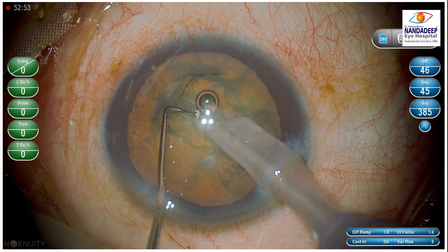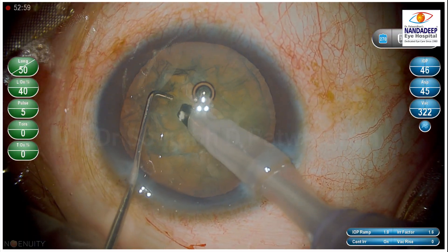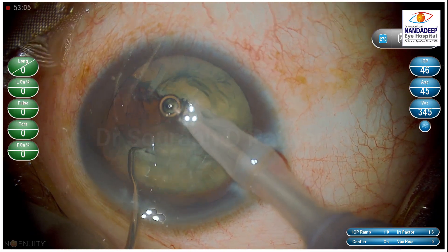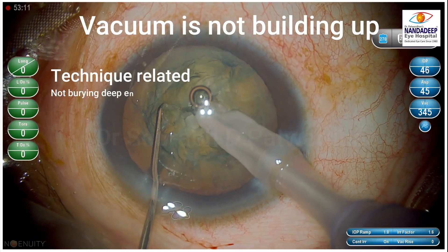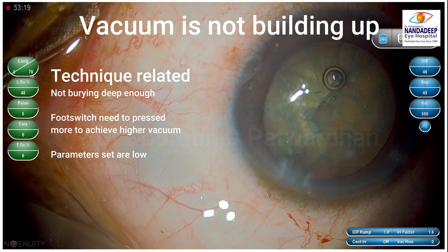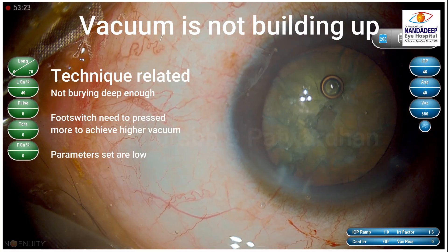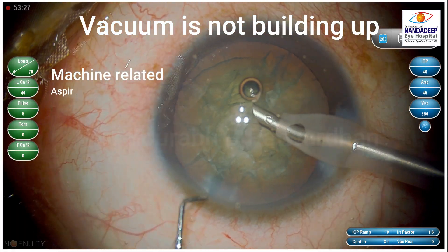Here I am doing the surgery and as you can see I am trying to do the chop. I finally achieve the chop by mechanical separation, but I am not getting a good hold. It could be because I am not burying deep enough, or the foot switch needs to be pressed more to achieve higher vacuum, or parameters are set low. But being an experienced surgeon doing everything right, it's still not happening.